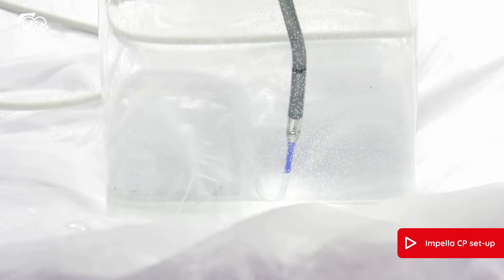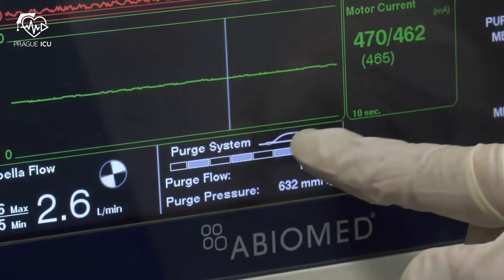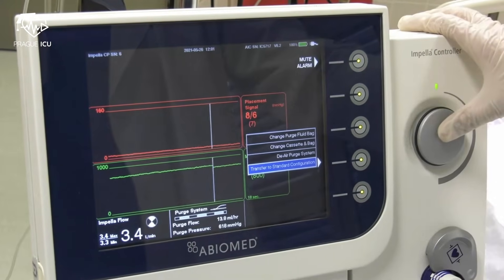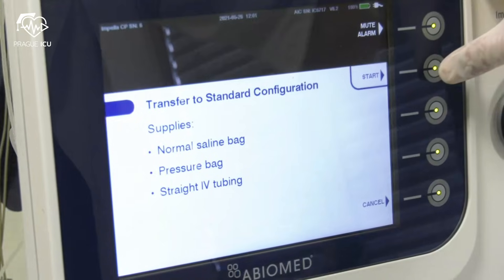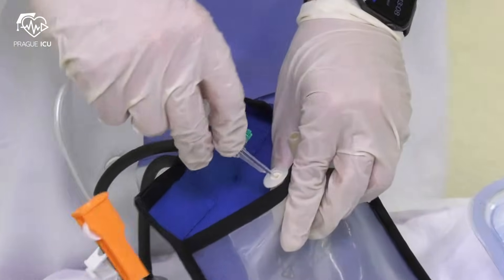If the patient is going to leave the cath lab, set Impella to standard configuration. This icon means that Impella is not in standard configuration yet. Push the purge menu soft button, then choose and confirm transfer to standard configuration by pressing the rotation knob. Follow the instructions and prepare the saline bag, pressure bag, and IV tubing.